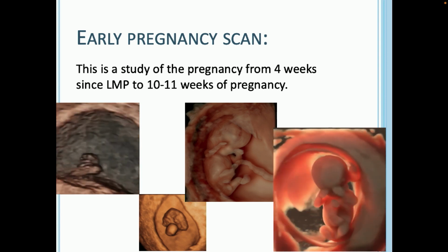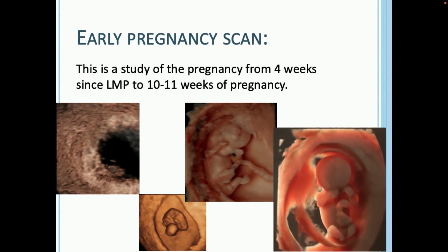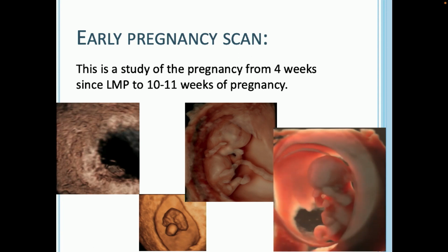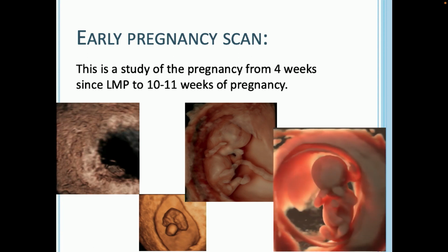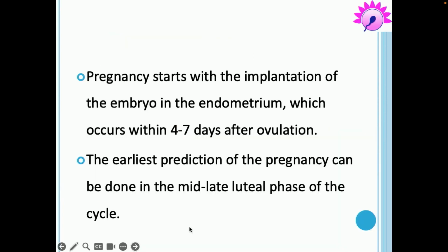And yes, it is right that you are not doing 3D, but this is not to fascinate you. It is truly to explain to you how much a 3D can do. It can show you the details of the anatomy so very beautifully that you can never ever make a mistake in diagnosis.